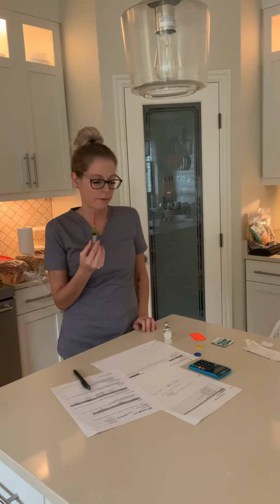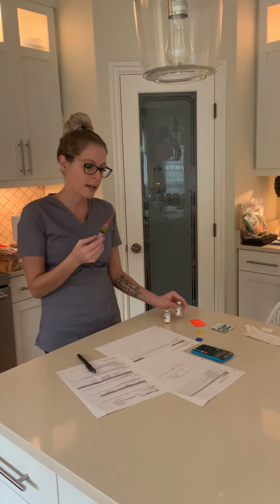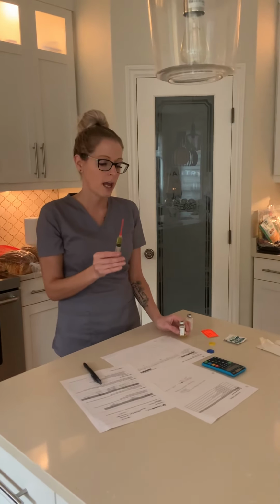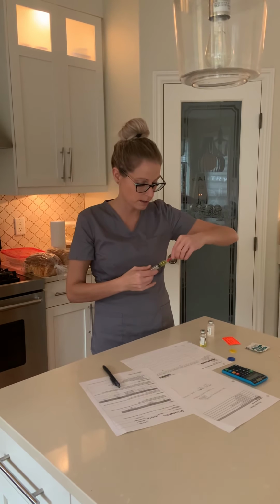I'm going to double check this with a nurse. I would ensure that my student or my clinical instructor was with me when I was doing this, but it's super important, especially for babies under 5 kilograms, that we double check our medications with the primary nurse or another nurse to ensure that we are within safe dosing. So again, a nurse would verify that this is how much I'm giving, and compare that with this dose, just to again ensure the safety of the patient, and she would be a co-signer as well on the MAR. So I feel good now going ahead and taking this off.